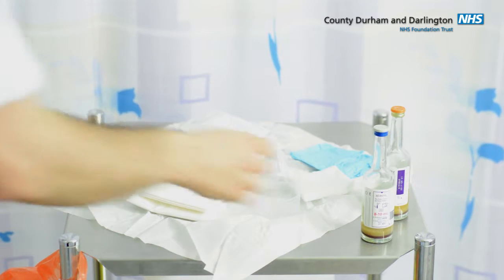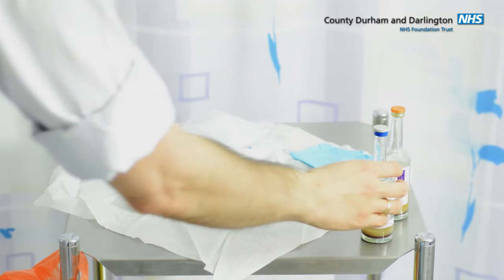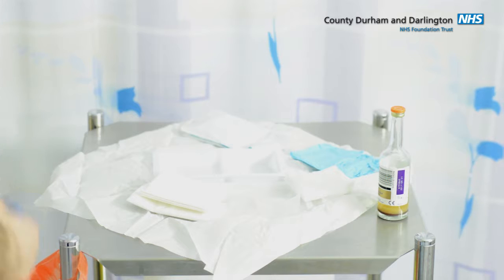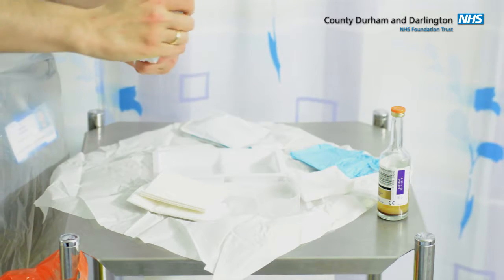Open up a green Clinell wipe, which has got alcohol and chlorhexidine, and clean the top and the neck of the blood culture bottle. Use a separate wipe for each bottle and place at the side and allow to air dry.